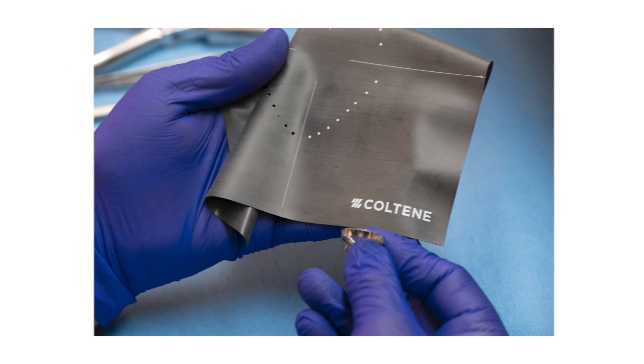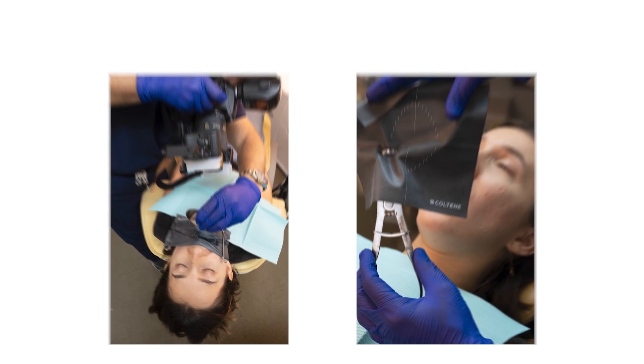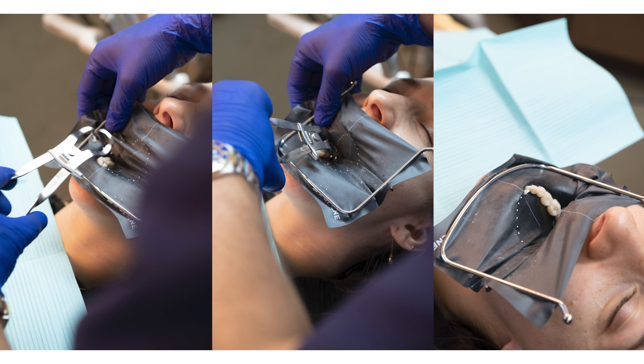You can see how many cases are shared every single day in relationship to dentistry, and the quality of our images is going to improve substantially when you have great contrast between the white of the tooth and the black rubber dam. That's going to allow us to have better photos and better things to share.